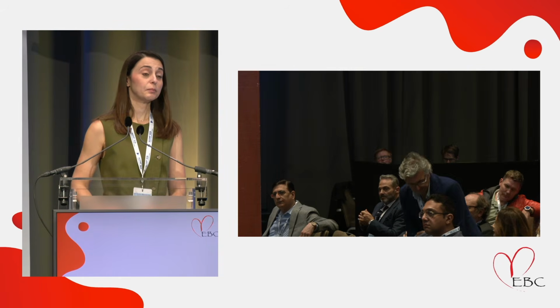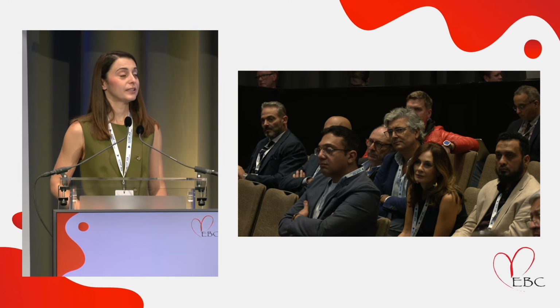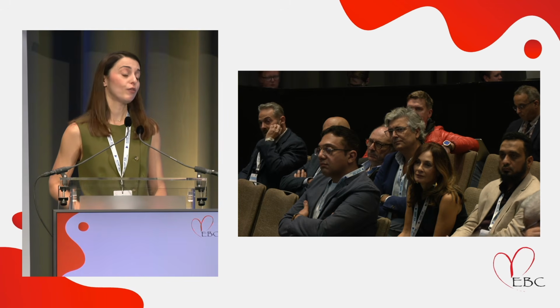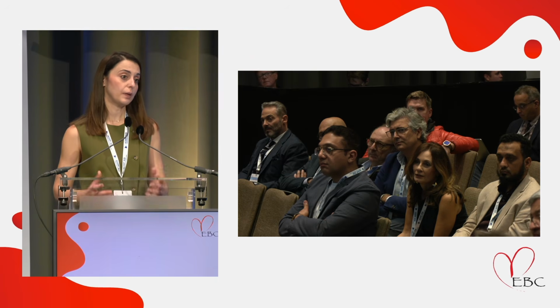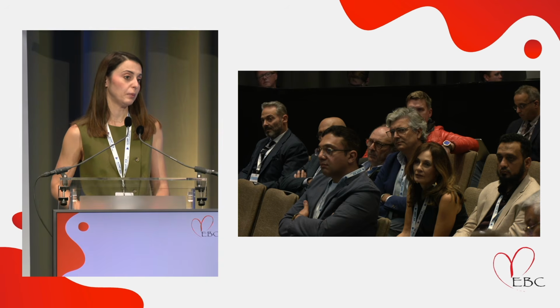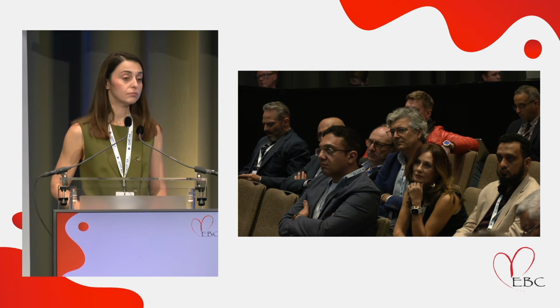I mean, it's a large vessel, it's the LAD, so we wanted to open the stent struts. We wanted to make sure that we had a good result, and nobody would stop at that point. Not quite routinely, but we very often recross and kiss, and in this case we finished with a DCB. MLA was 5 square millimeters, and the LAD ostium wasn't entirely normal.